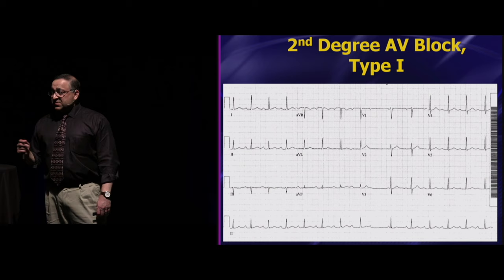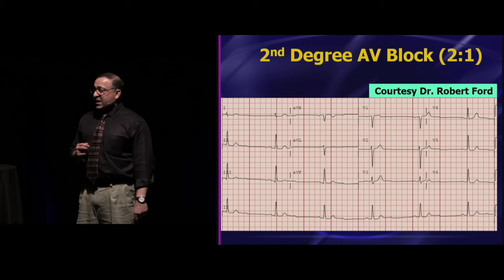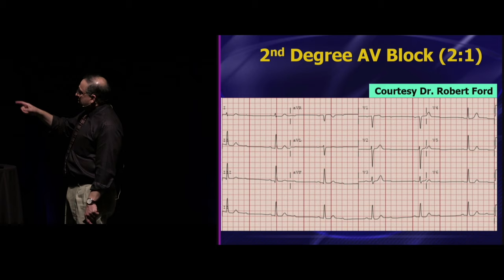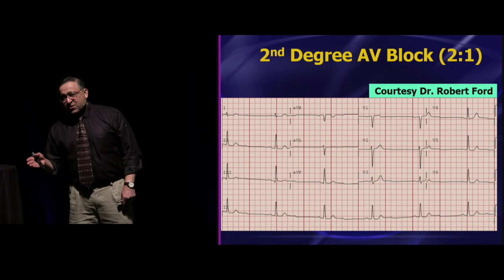All right? Now, there's one special type of second-degree AV block, and this is just a matter of semantics, but you may encounter this issue. In fact, this physician actually sent this case to me just a couple days ago, where there was a little bit of a dispute with the cardiologist. He was saying that this is Mobitz, and the cardiologist was saying, no, it's not. So, let me go back for just a second. This is Mobitz 2. Everyone's okay with that.